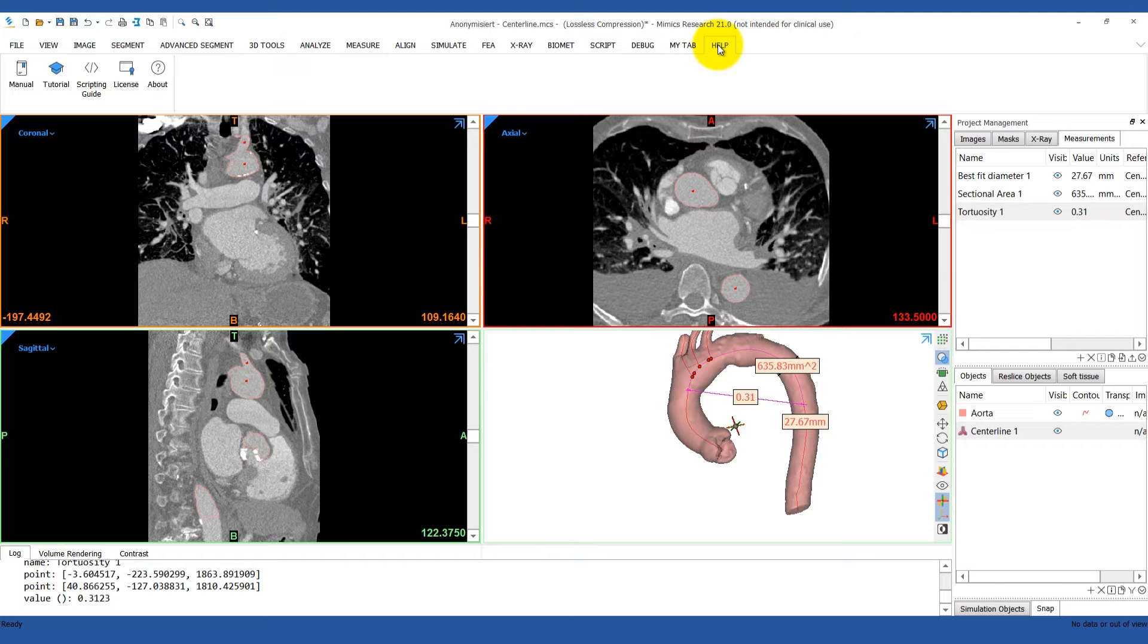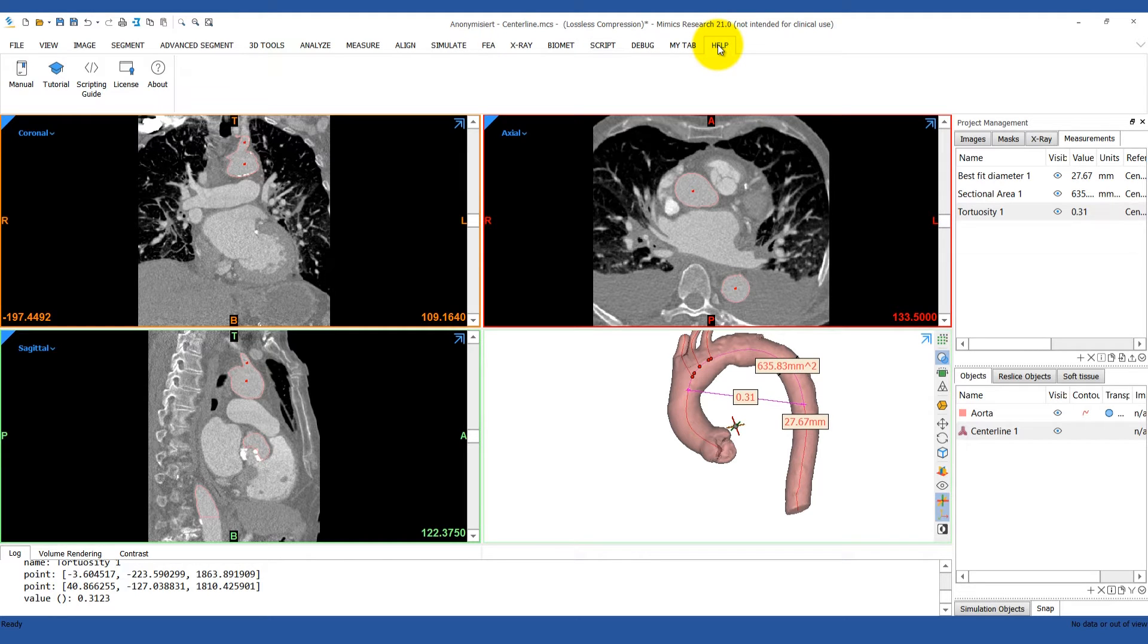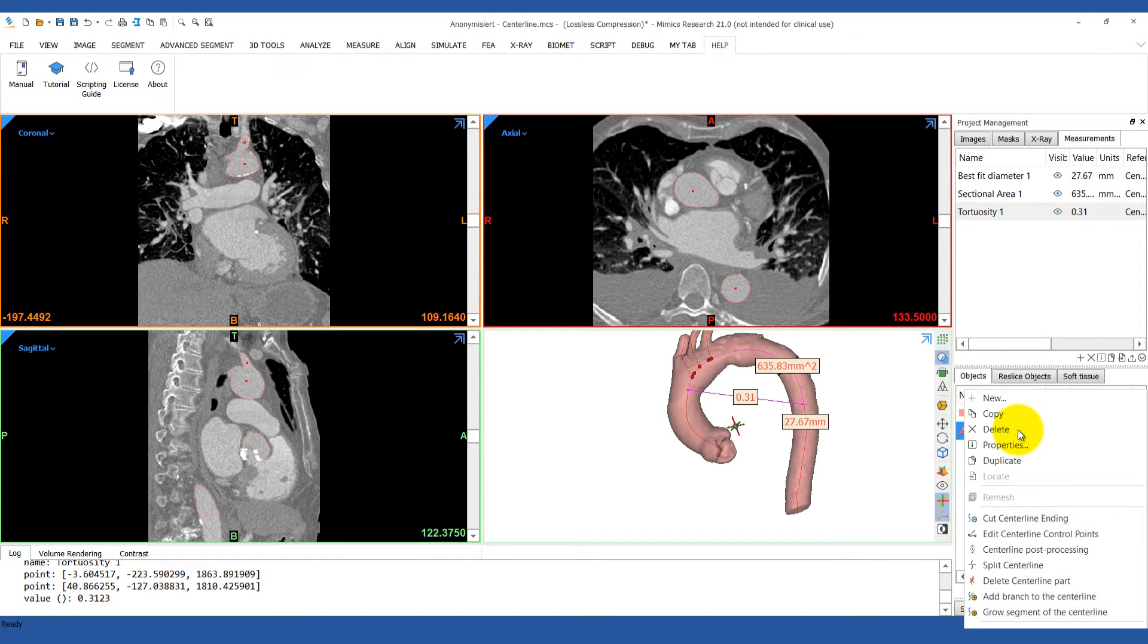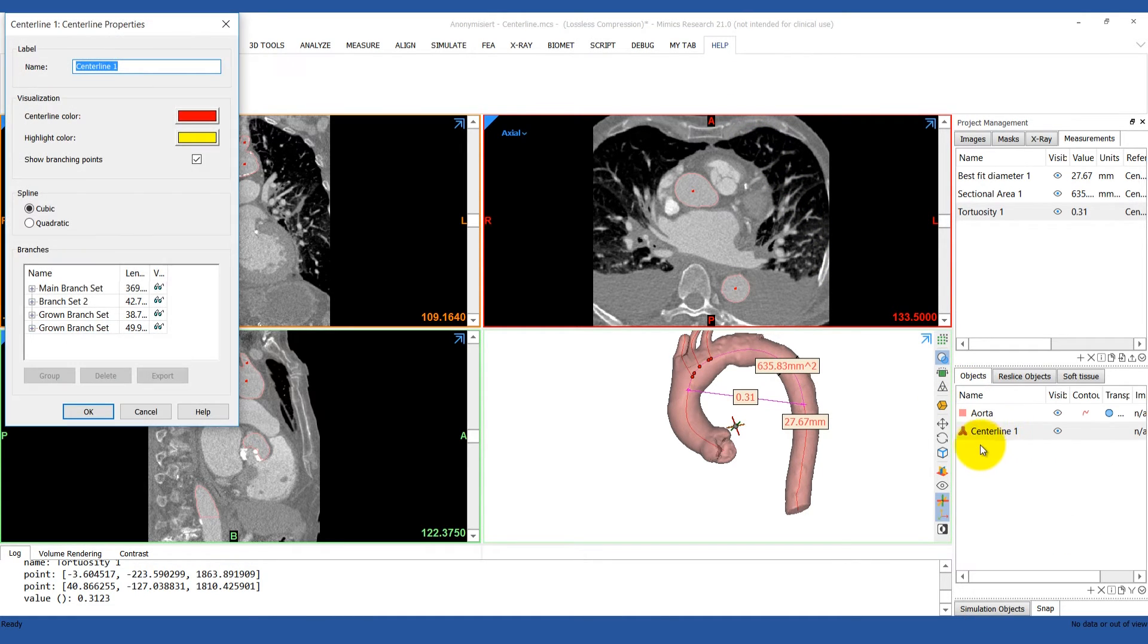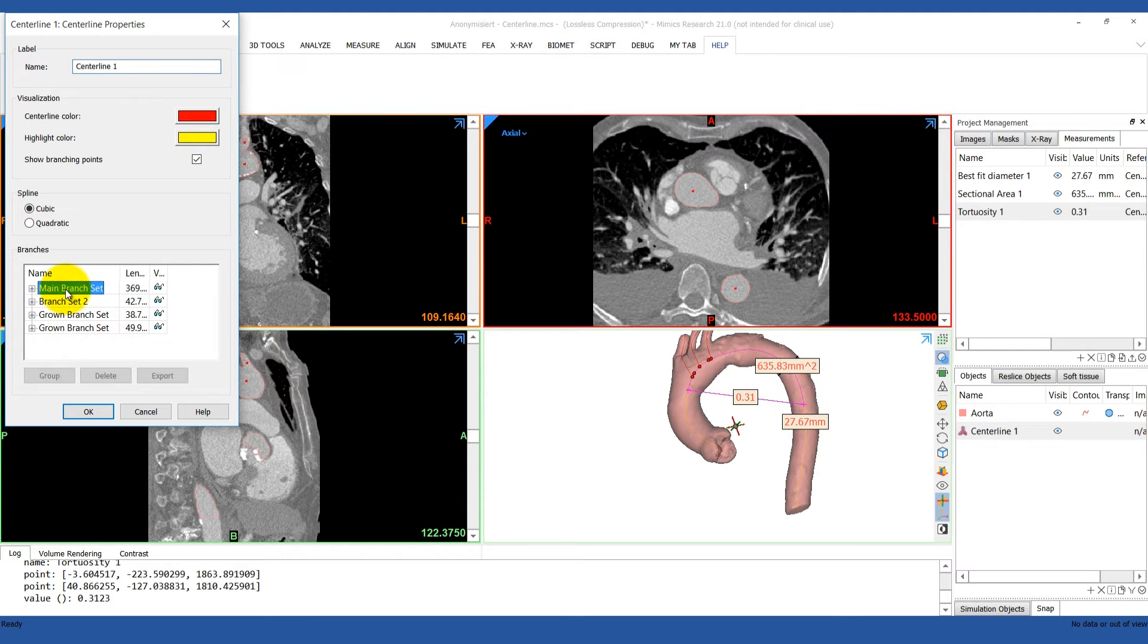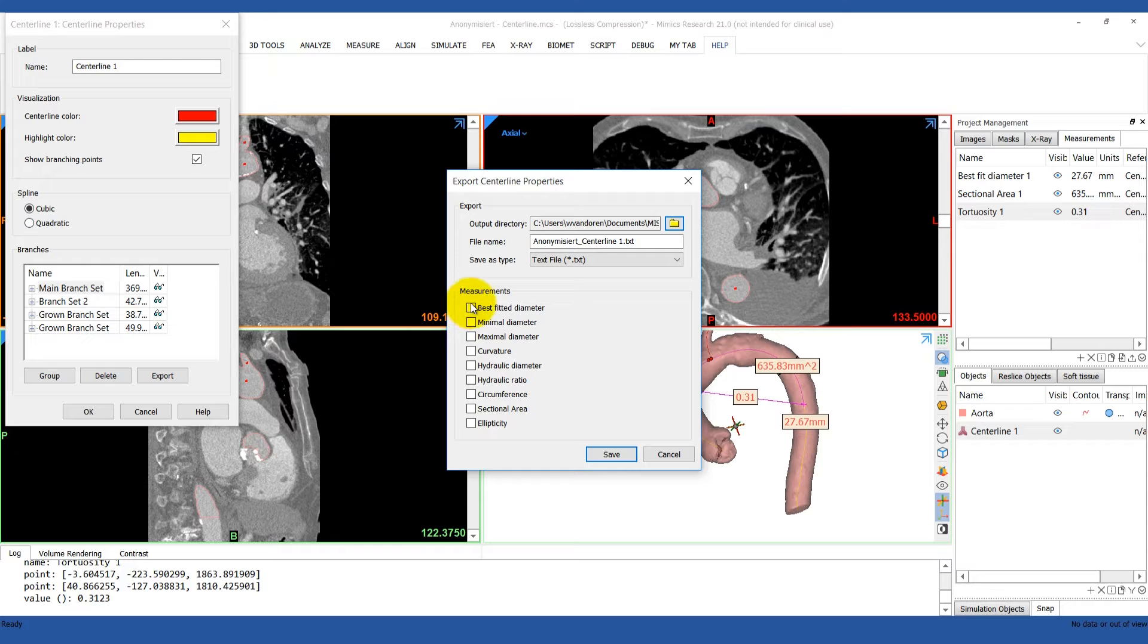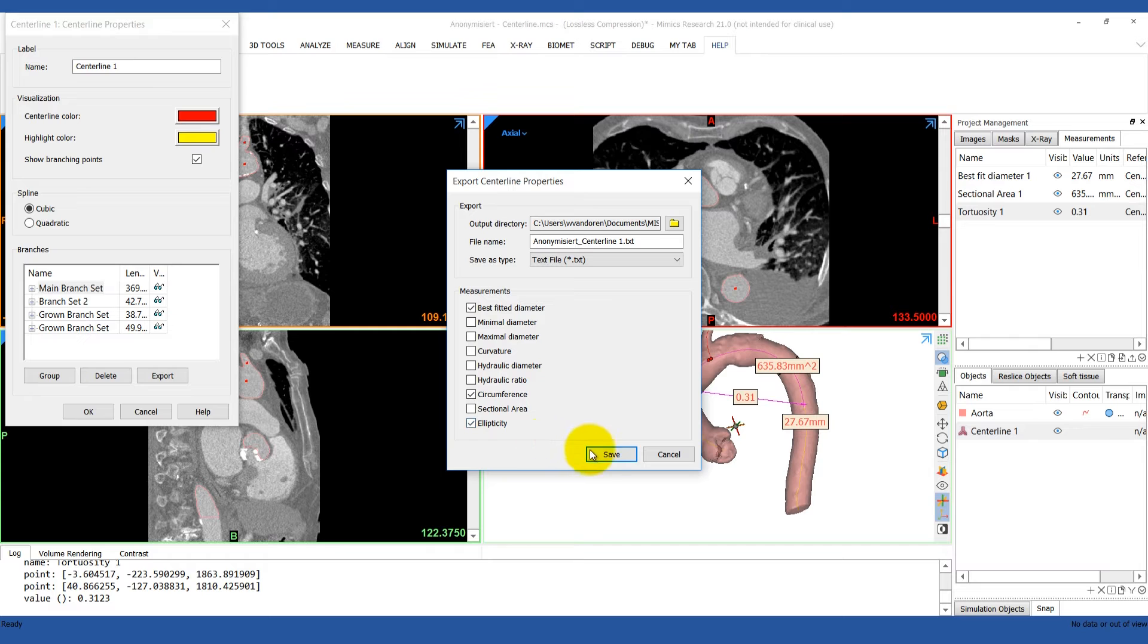Now, let's say we want to take a measurement of one of these centerlines throughout an entire branch. There's a much faster way to do this than working with individual points. First, click on your centerline and then on the Properties tab. Choose which branch you want to measure, and it will get highlighted in the 3D view. We're going to choose the main branch. Now click Export and choose the measurements you're interested in. Choose your output directory, file name, and hit Save. This will export out a text file listing the selected measurements at each of the control points in that branch.